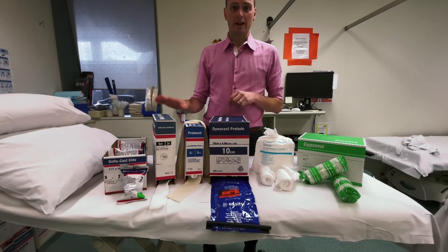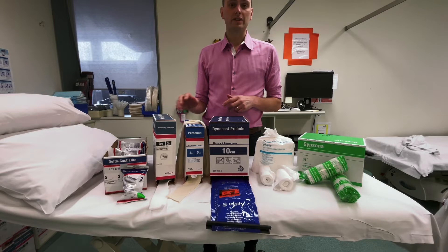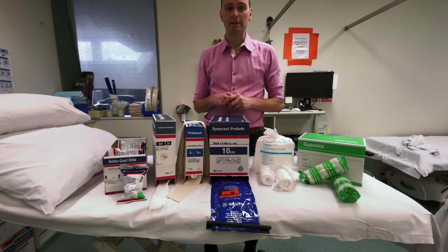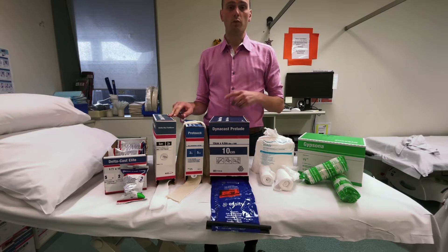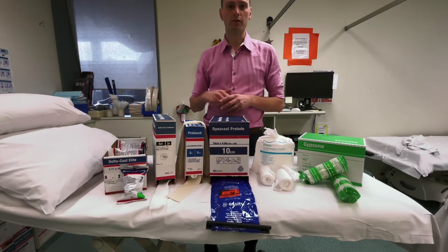Another option we discuss in our plaster instruction session is the Delta Dry, which is a version of a stocking that is actually waterproof. We typically use two layers of it, and patients can get it wet so long as they use a waterproof outer cast material, which is synthetic, and we talk about that later on.